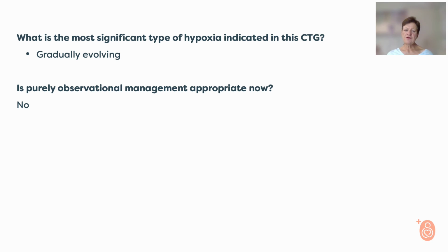Again, we can't only do observational management. We can't just put the patient on a continuous CTG and wait to see what's going to happen. We have to act actively and start with intrauterine resuscitation measures.